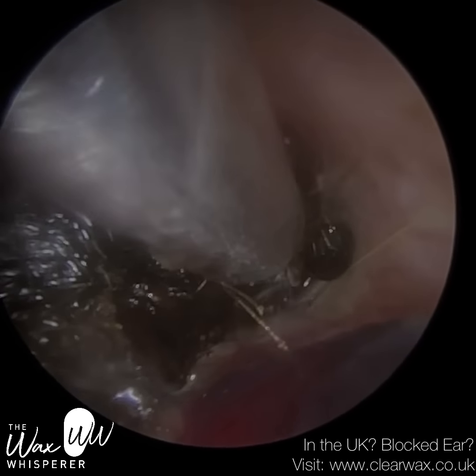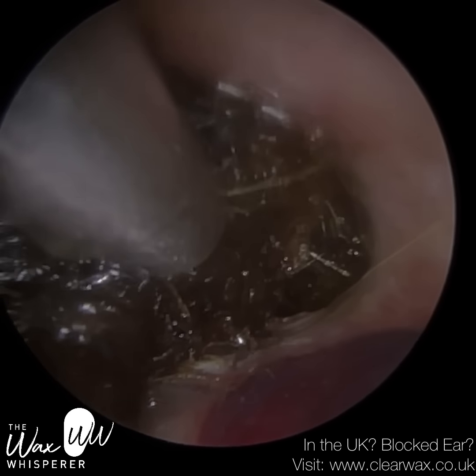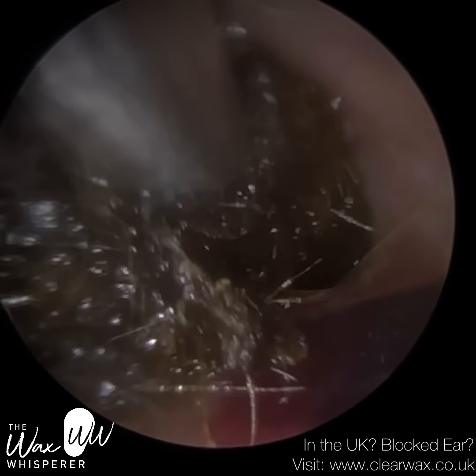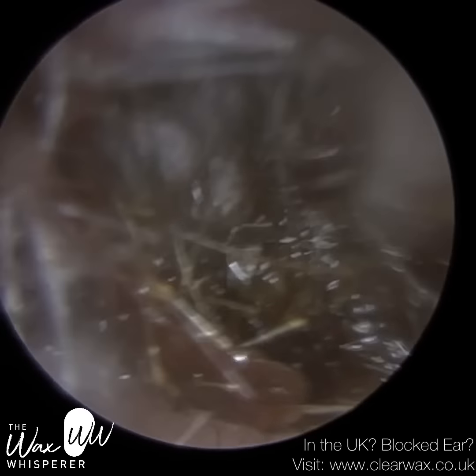More than likely, the water seeped in behind the wax plug and formed a puddle. Also, the earwax plug absorbed the water and expanded and swelled, creating more of a blockage in the ear.